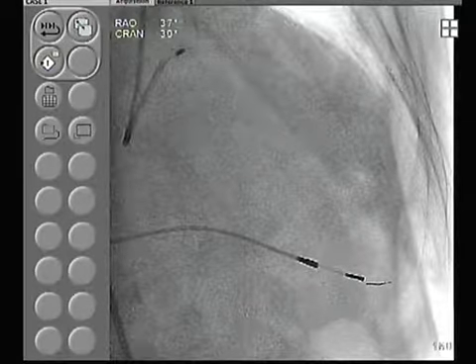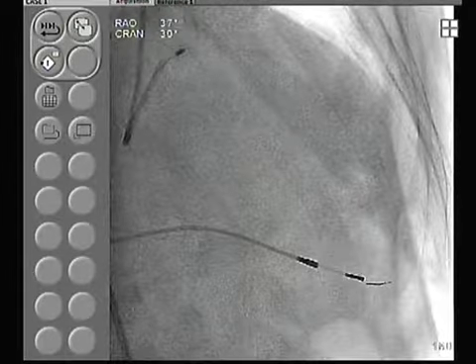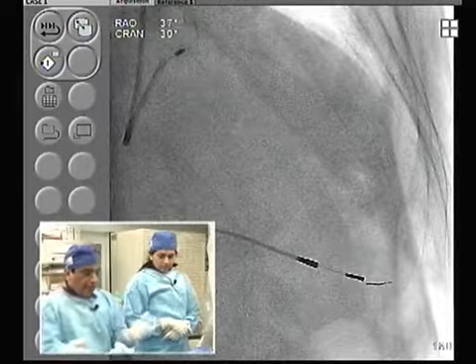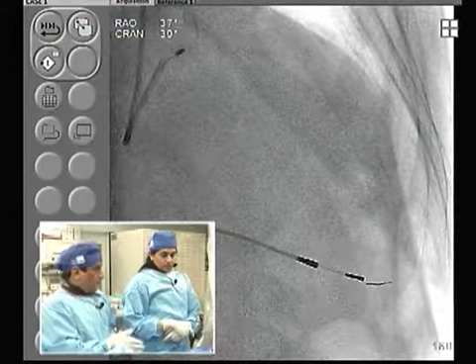You're right. In this particular case there is no issue, because both lesions will be taken care of today unless some complication occurs. And that is the principle of multi-vessel intervention: you have to have a good result of one before you go to the second.